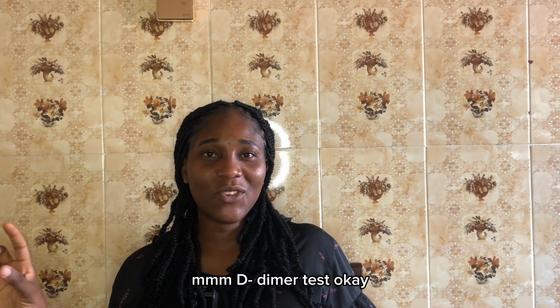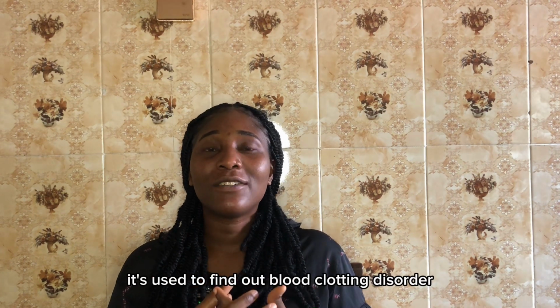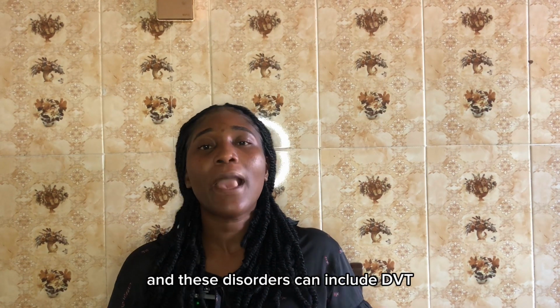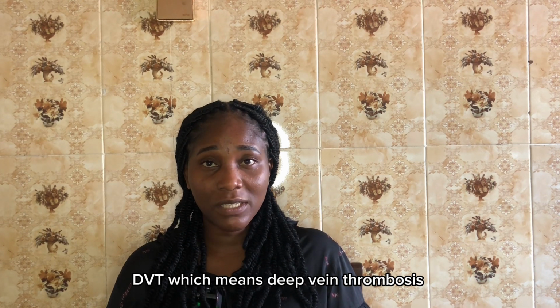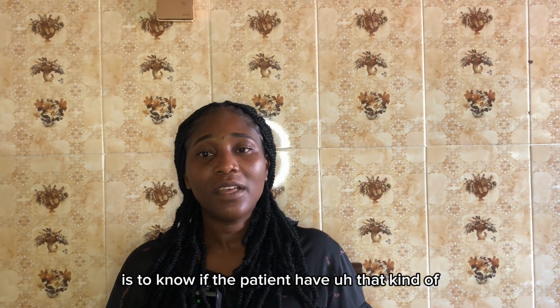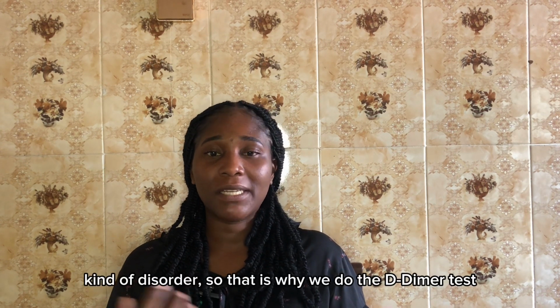D-dimer test. Okay, so the D-dimer test is a protein test. It's used to find out blood clotting disorders, and these disorders can include DVT and PE. DVT means deep vein thrombosis. PE means pulmonary embolism. It is to know if the patient has that kind of disorder. So that's why we do the D-dimer test.